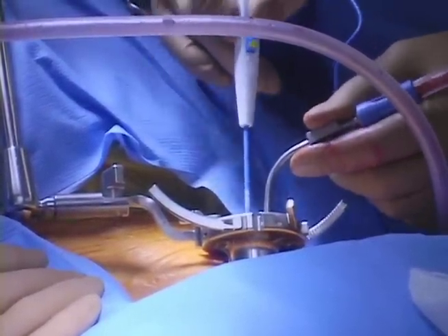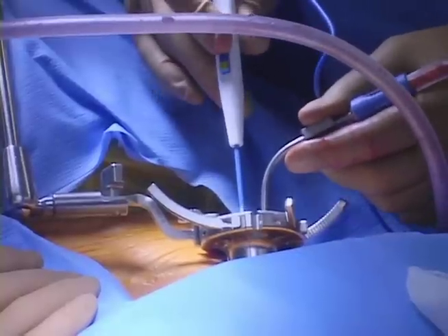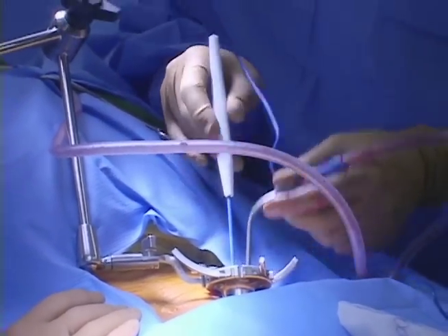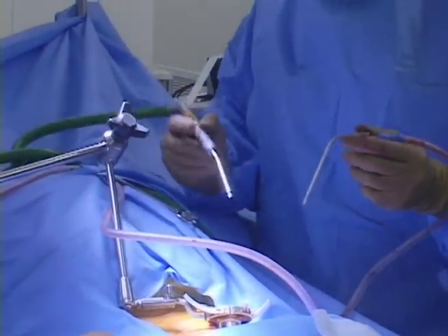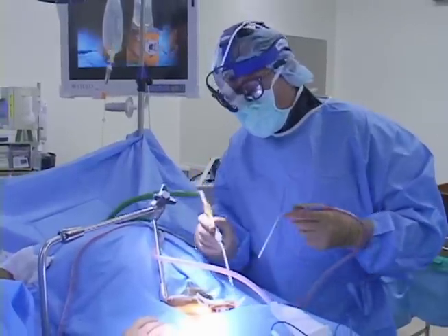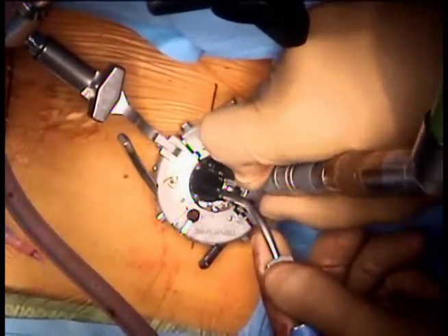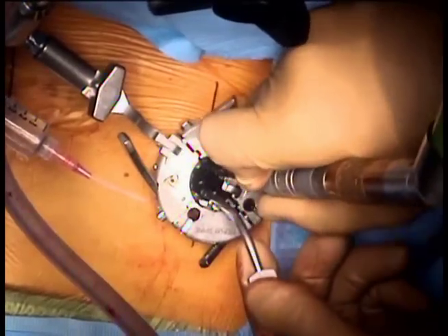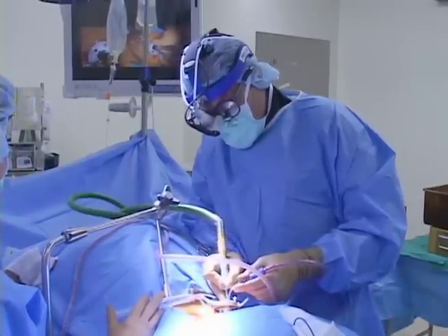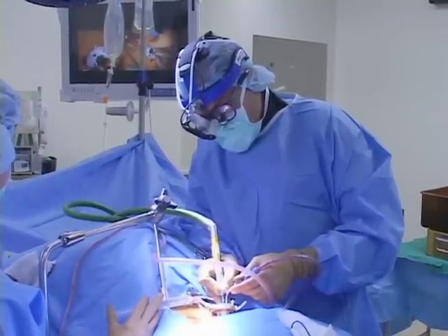We're coming down on the facet joint right here — this is my entry point. When I see the actual facet joint, this is the perfect point to come in for the MIS-TLIF because we're coming down through the joint and will take off the entire facet joint. The next step is to burr down the facet joint. I have a special MIDAS attachment that is bent and slightly curved, so it fits into the retractor nicely, keeping my hand out of the field. As long as I'm seeing white cartilage, I know I'm within the joint. When I start to see red, I'm getting down into the bone of the facet joint itself.